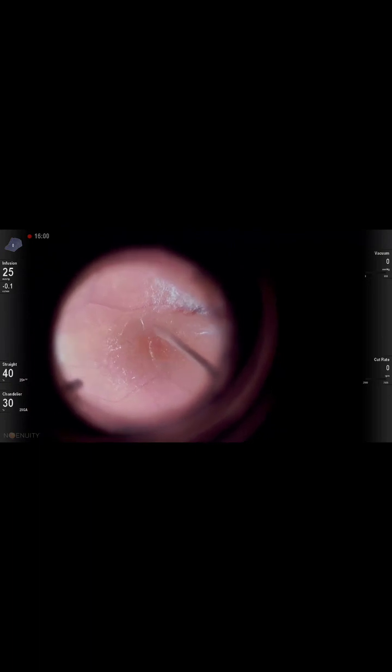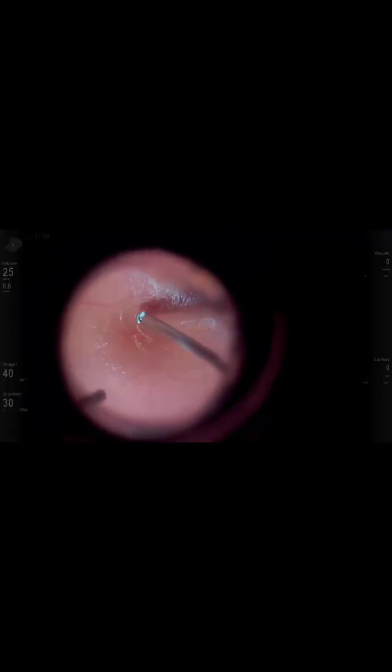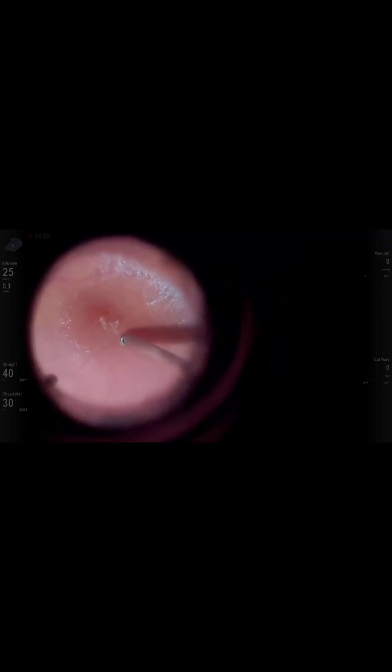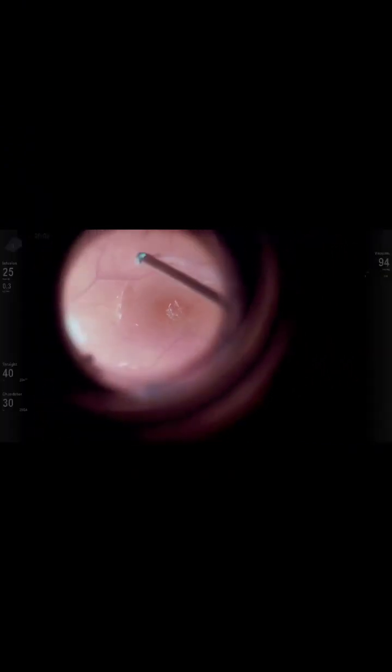Next, he uses the vitrector probe with low vacuum settings, and performs circumferential trimming, in order to separate the posterior hyaloid from the foveal region and the periphery. Patients with vitreomacular traction syndrome exhibit abnormal vitreoretinal adhesion, and therefore, when performing maneuvers to detach the posterior hyaloid, it is also necessary to be very careful not to cause iatrogenic tears in the peripheral retina.